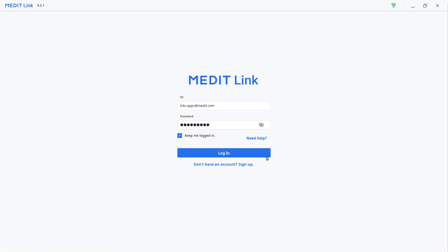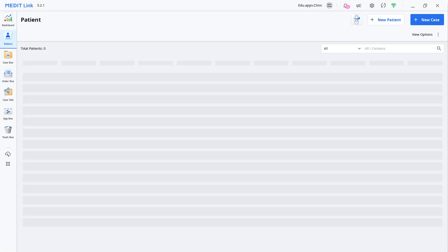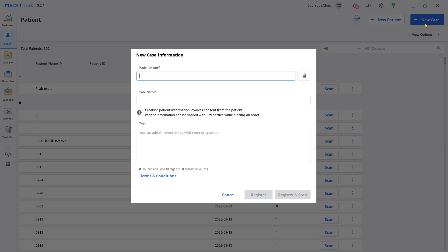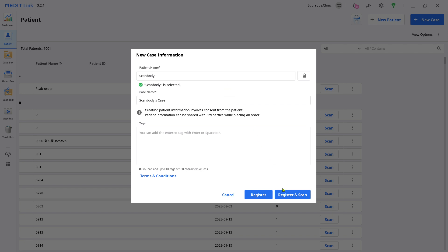Now let's scan. Log in to your MeditLink account and create a new case.